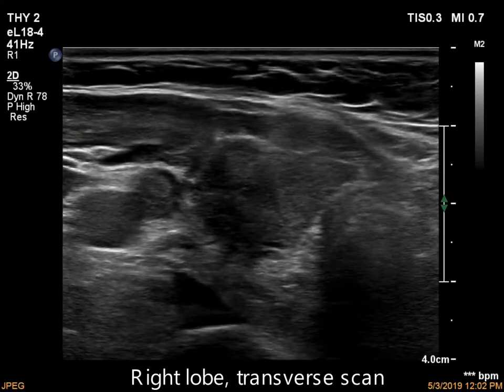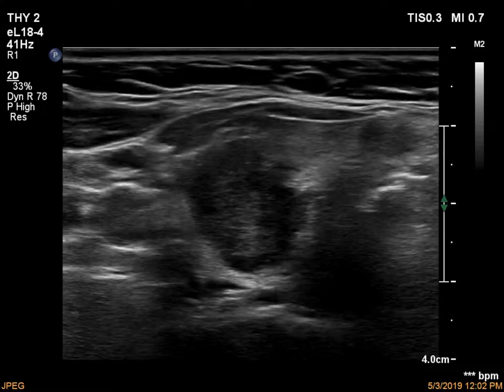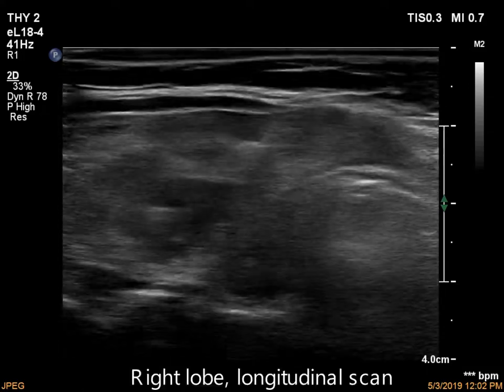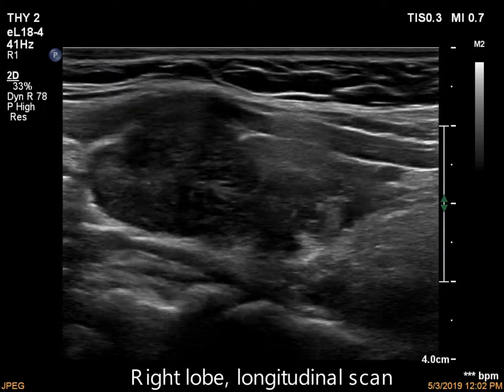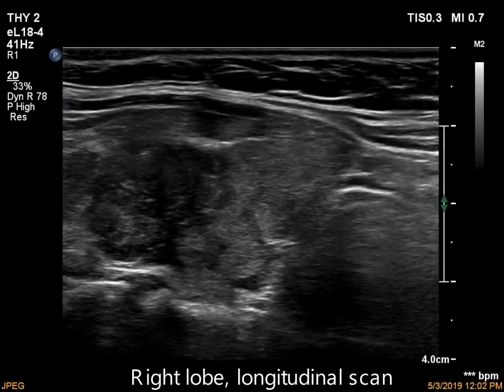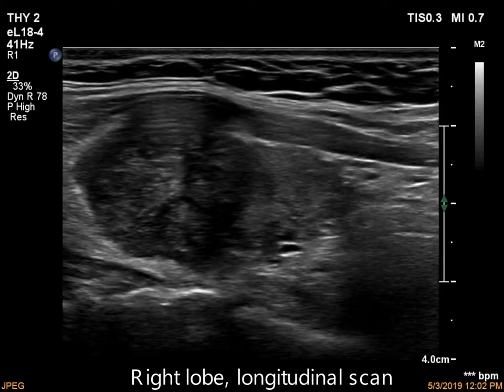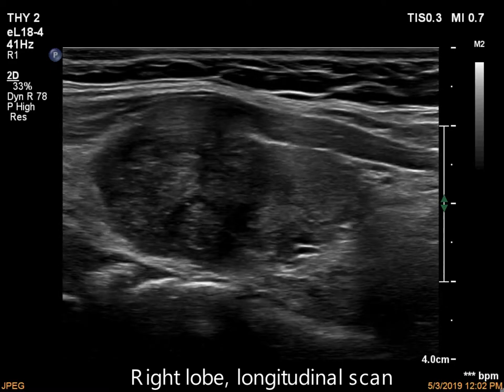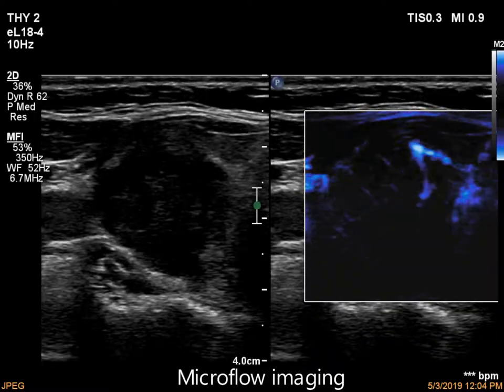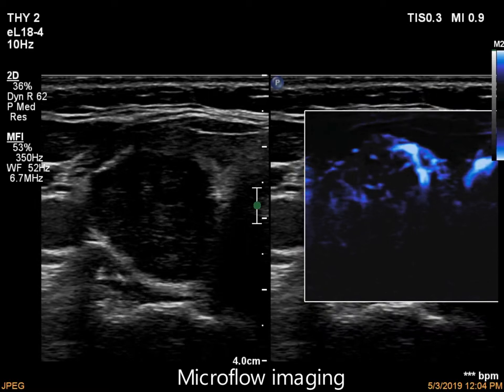There is a large hypoechoic lesion in the right lobe. The lesion presents irregular, lobulated margins. The vascularization is decreased on microflow imaging.